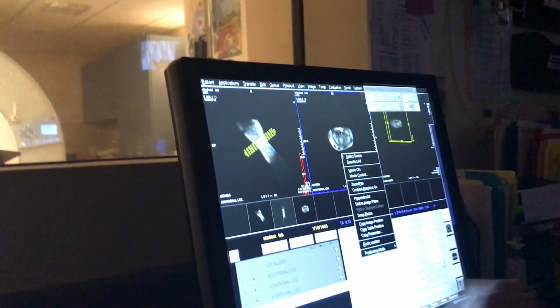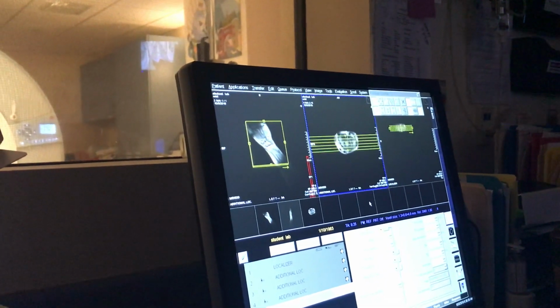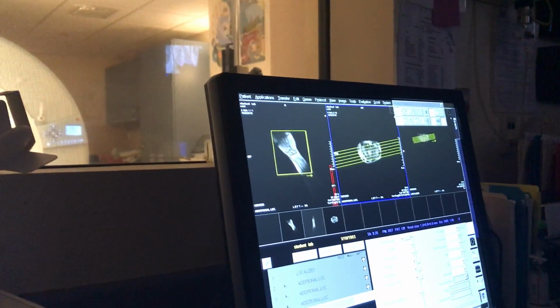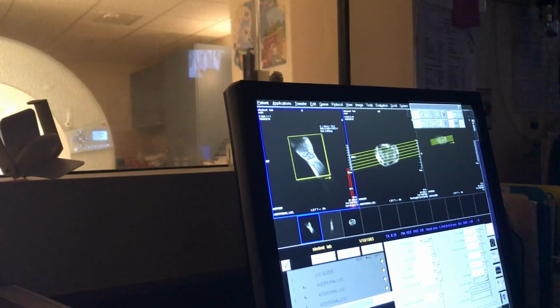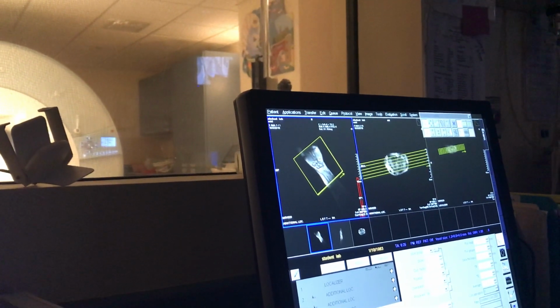So I just dragged that one scan down, clicking on my axial image and going perpendicular off of that, angling. And note here, for your second localizer, we have the ability to rotate that. So now the image comes up appropriately for you.